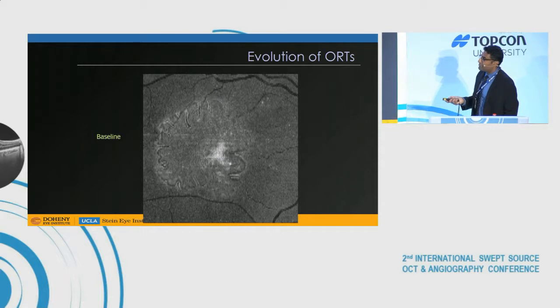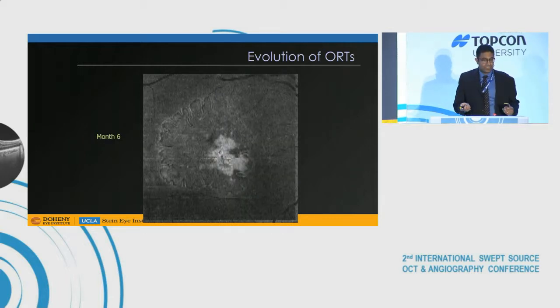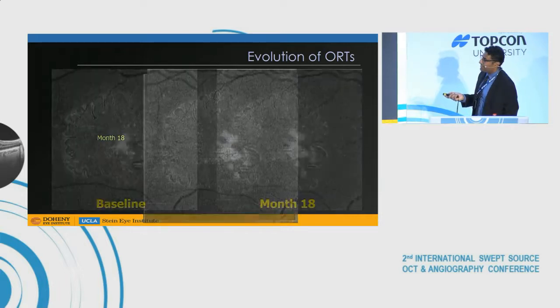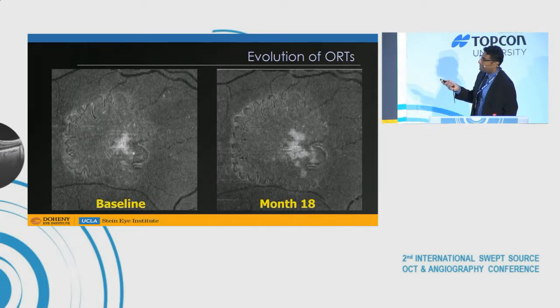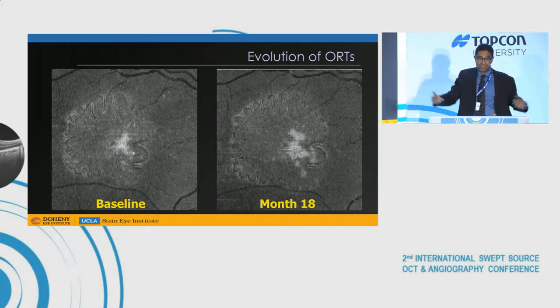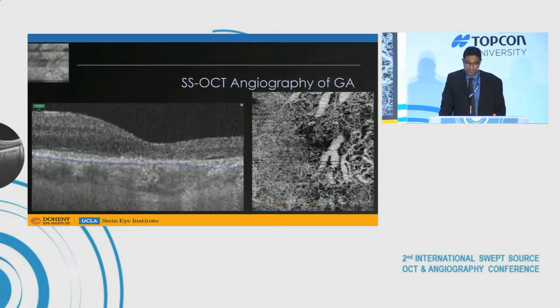And we've been very interested in tracking the evolution of these using swept-source OCT. It's interesting as you track these along, they always connect back to the edge, but there is a dieback over time. I've always viewed these as conduits that are trying to keep the photoreceptors at the very edge alive, but obviously you can only do that so long. The conduit, once it gets long enough, I think you're over the cliff.